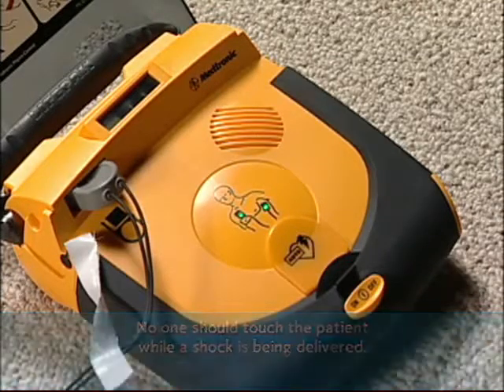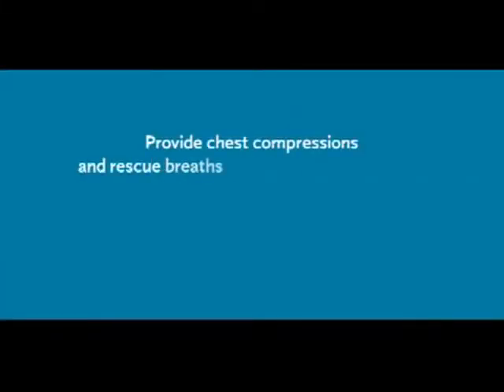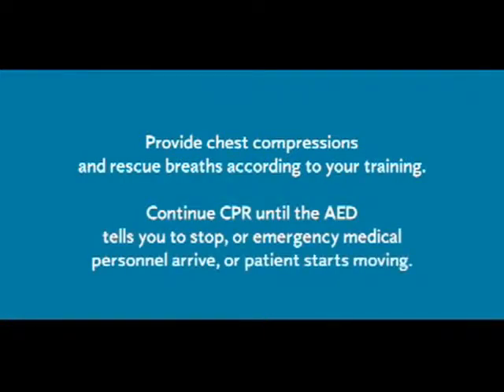Shock delivered. Provide chest compressions and rescue breaths. Provide chest compressions and rescue breaths according to your training. Continue CPR until the AED tells you to stop, emergency medical personnel arrive, or the patient starts moving.